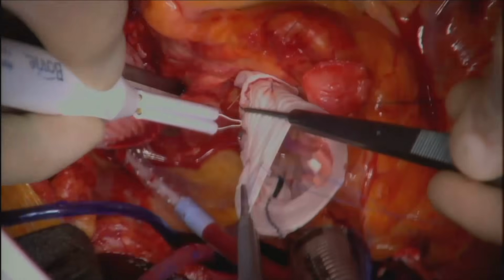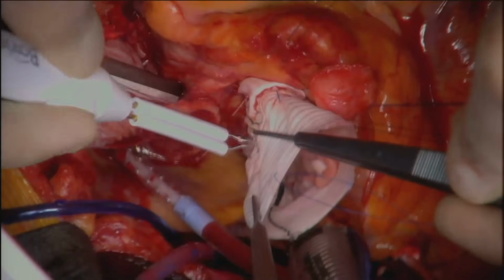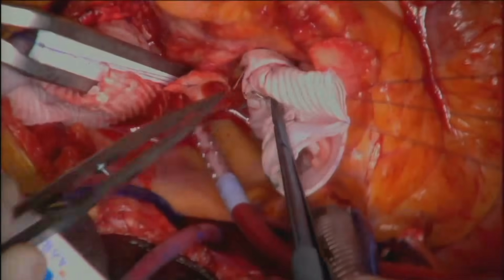The left coronary button was implanted into the back side of the graft with a running 6-0 suture.